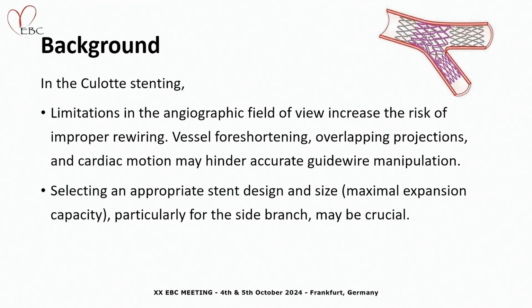In the culotte stenting, limitations in the angiographic field of view increase the risk of improper rewiring. Vessel foreshortening, overlapping projections, and cardiac motion may hinder accurate guide wire manipulation. Additionally, selecting an appropriate stent design and size may be crucial.